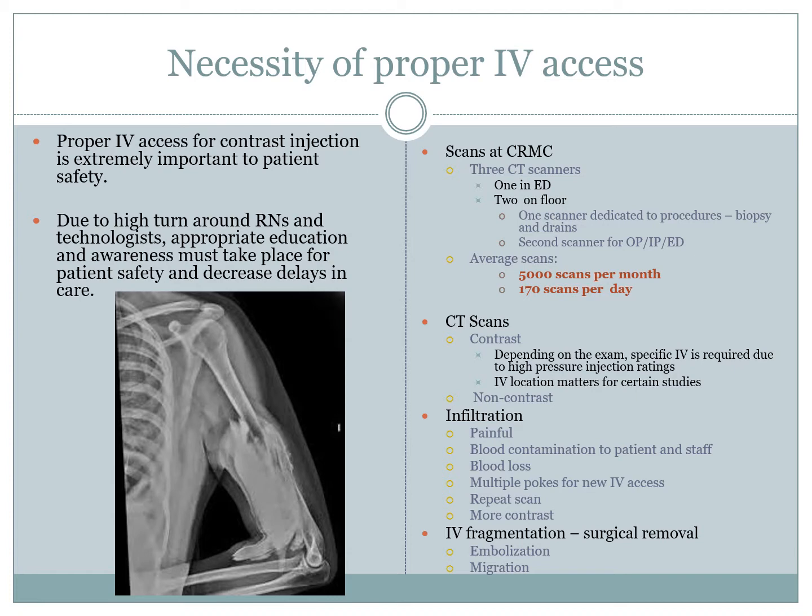So the lack of education and awareness among the CT technologists themselves, the nurses who take care of the patients, and the physicians who are the ones who order the scans, all need to be educated with what proper IV access is specific for which protocol, because having the improper IV can cause a delay in patient care.